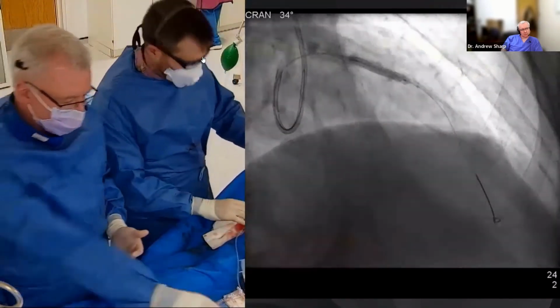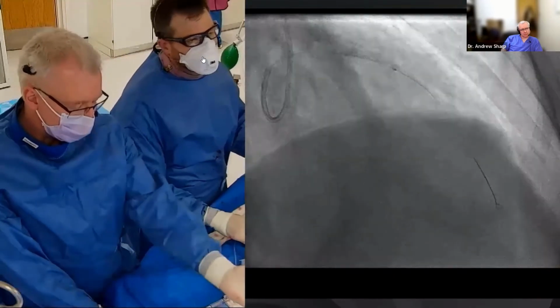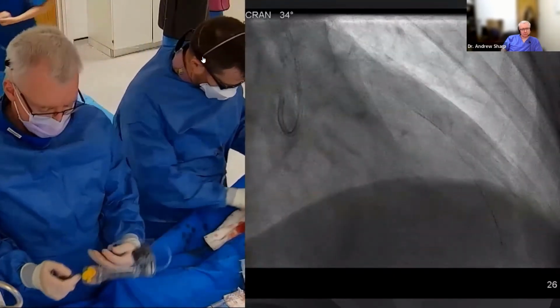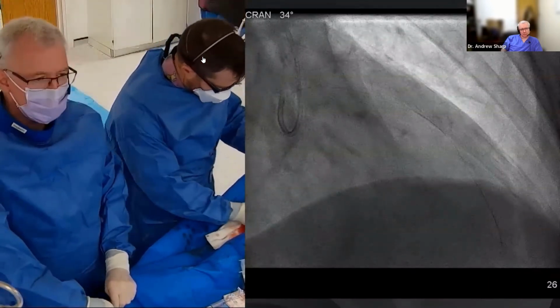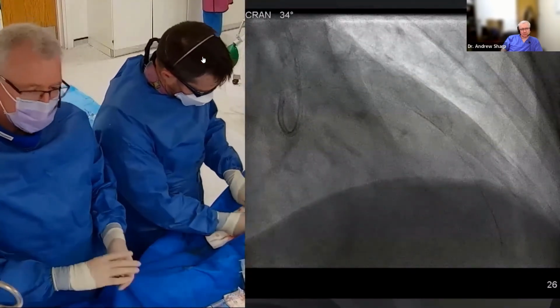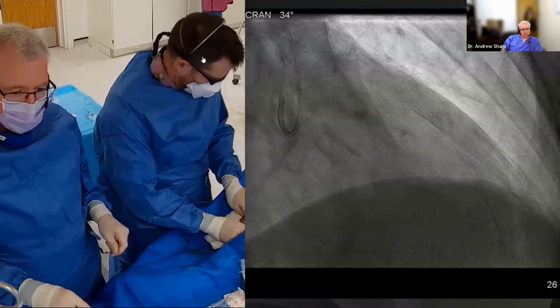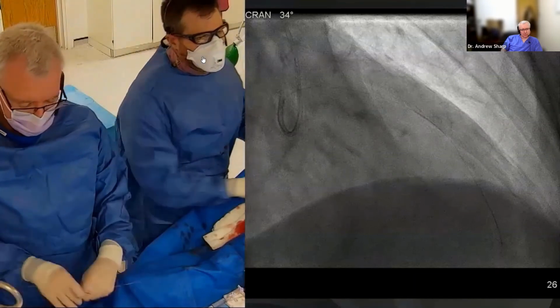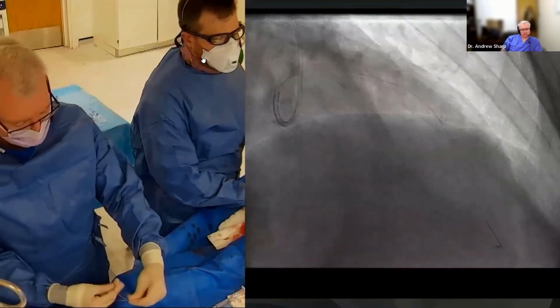So it's not that we need larger diameter. We've taken 3.25 above either of these measurements. It was 2.5 in one plane and 2.9 in the other. What we need is higher pressure to release it to the diameter of the balloon. So hopefully we've done that now. As mentioned, you do have to be a little cautious. 3.25 at 22 will go to about 3.4, 3.45 millimeters, which is a little beyond the media to media diameter we measured at that point at the beginning.